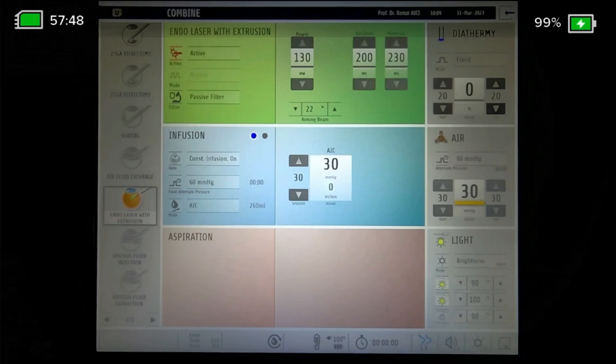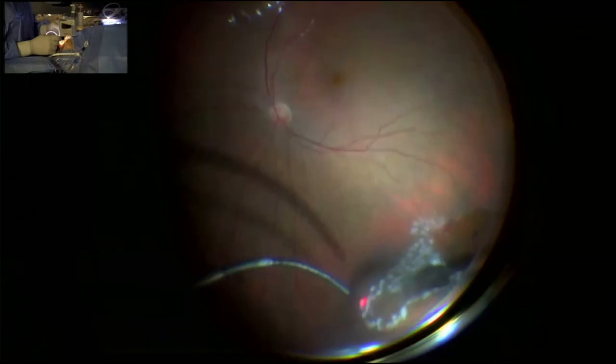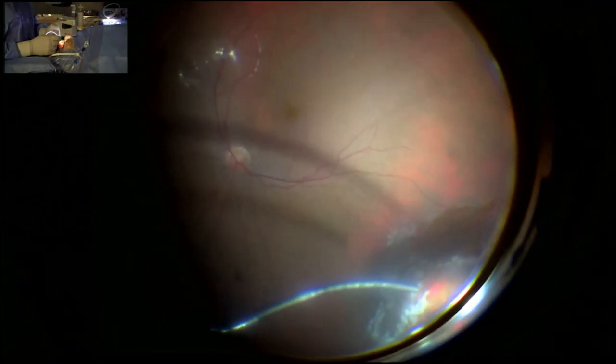There is lattice elongated until here, and therefore I'm doing laser in this area. The other discussion is whether to do laser 360 or only the retinal tear. Usually, a young or inexperienced surgeon prefers 360 laser. Actually, if we are sure that there is no tear in the other part of the retina, I think it's not necessary to do laser all 360 degrees on the periphery, because more laser means more inflammation. Therefore, I prefer laser only in the retinal tear area, not the other area.